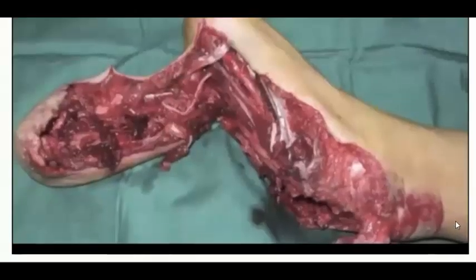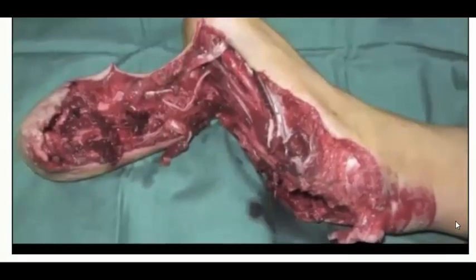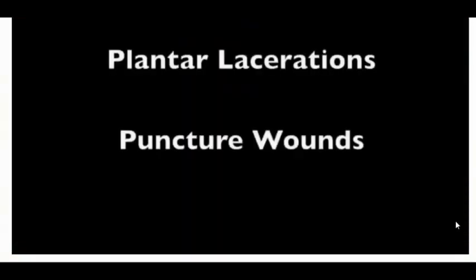Here we will review the indications and equipment required. We will then review the relevant anatomy and the specifics of obtaining reliable ultrasound images and successfully performing this nerve block. The indications for this procedure are straightforward. Plantar trauma, usually lacerations or puncture wounds. This is a difficult area of the body to anesthetize in a traditional sense.